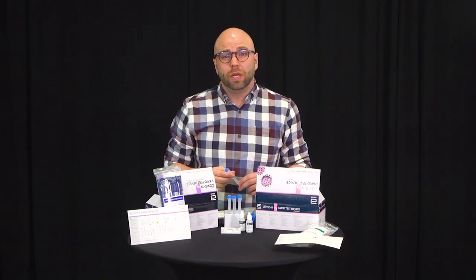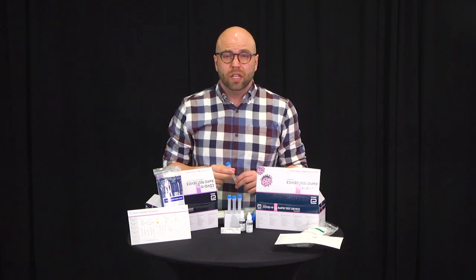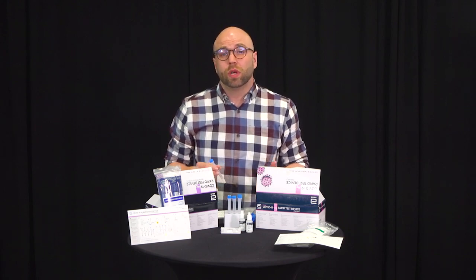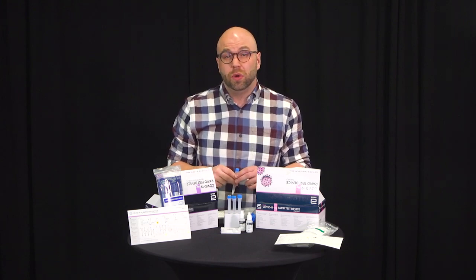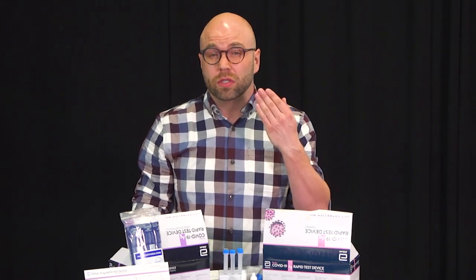In your workplace, the test will be done under the supervision of someone who is trained on this process to ensure the sample collection and the test is done properly. However, for this video, we're showing you how a self-collection works. First, we'll demonstrate how to do a swab using a nasal swab, and then we will show you how to do a nasopharyngeal or NP swab. The NP swab is the one that goes all the way to the back of your nose.